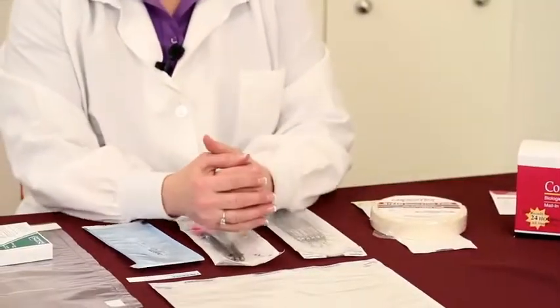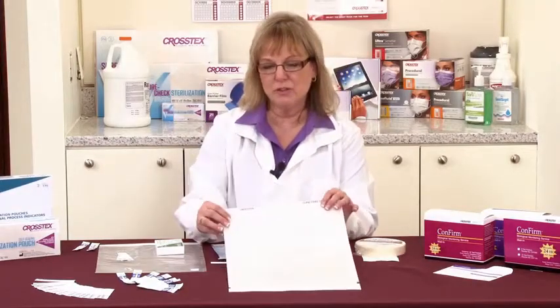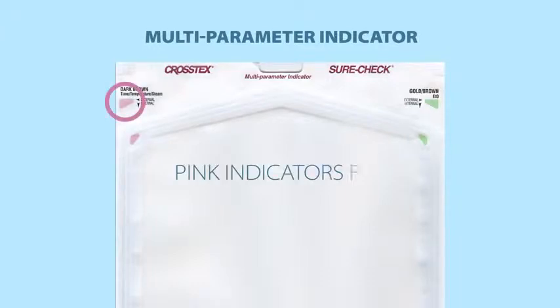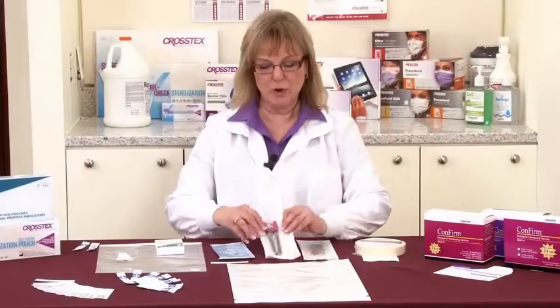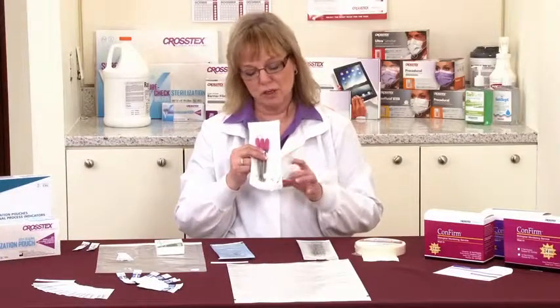The CDC requires that every package or pouch have an internal indicator that would ensure that the parameters of sterilization have been met. An example of a multi-parameter indicator is the SureCheck pouch. The SureCheck pouch has both an external as well as an internal multi-parameter indicator. These pouches can be used in either a steam sterilization process or in a chemical process. When the pouch has been processed appropriately, there will be a significant color change. In the case of steam sterilization, it goes from a pink to a dark brown color.